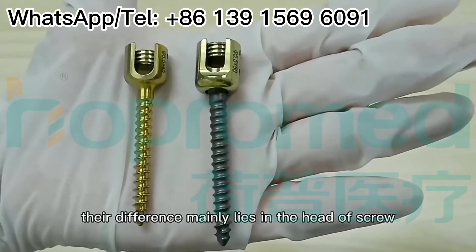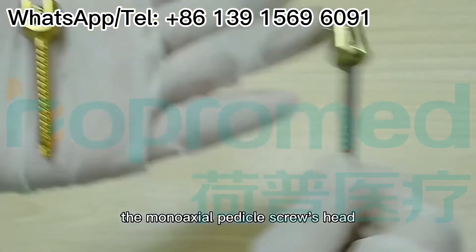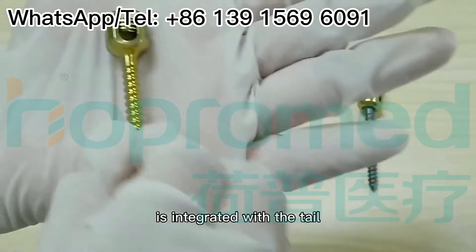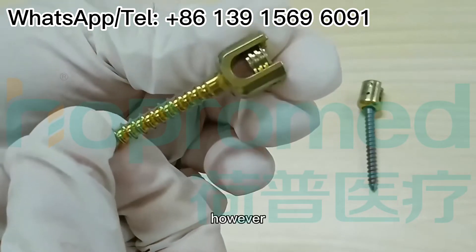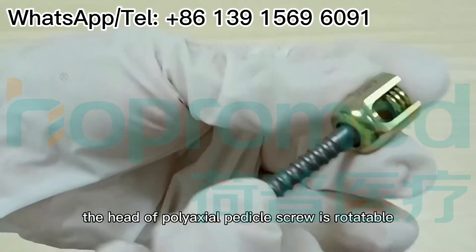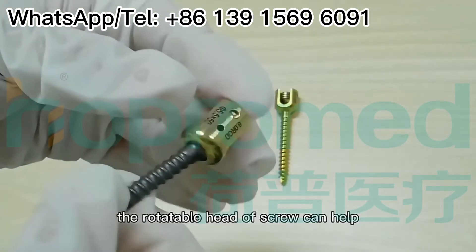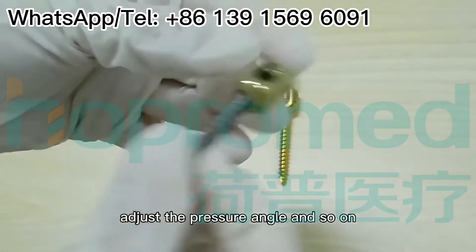The difference mainly lies in the head of the screw. The Mono-axial pedicle screw's head is integrated with the tail. However, the head of the Poly-axial pedicle screw is rotatable. The rotatable head can help adjust the pressure angle and so on.